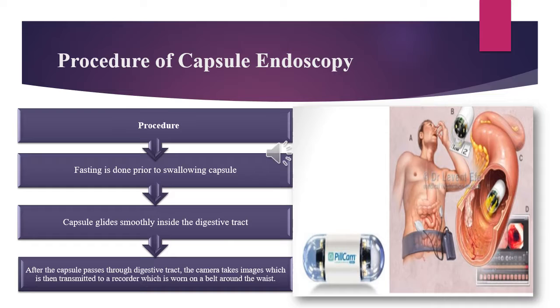The capsule is swallowed and travels, just like a piece of food, through the stomach, small bowel, and into the large bowel. Recording probes taped onto the abdomen track the progress of the capsule as it makes its way through the gastrointestinal system. The images obtained by the capsule are transmitted to a data recorder worn in a harness around the waist, and after 24 to 72 hours it passes naturally.